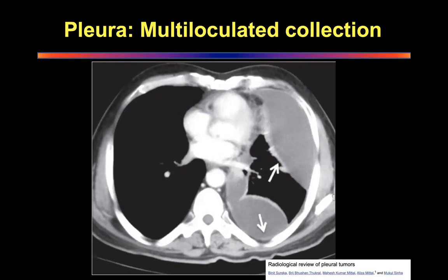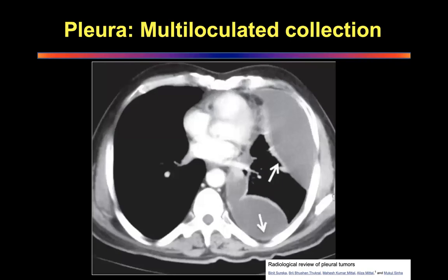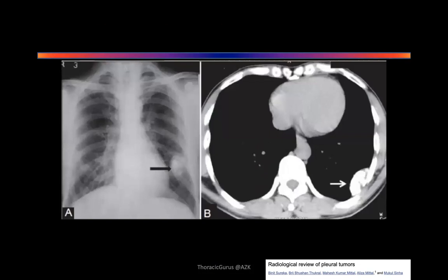Don't jump into mesothelioma straight away. Okay? If they ask you, you push into it, then you say that. But otherwise, describe this as a multiloculated pleural effusion. Okay? All right. Quickly, next. What is this? Come in. Who is next? Bhushan, Shilpa, whoever. If Abba is there, Abba can take it.